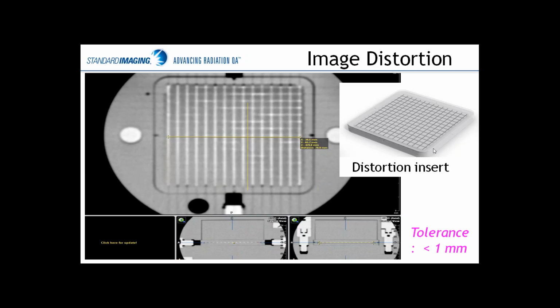The tolerance for this test is typically given to be 1 millimeter or less, and I will mention that most of the clinical information in this presentation has come graciously from one of our Lucy users, Dr. Anil Sethi down in Chicago. So a lot of the tolerances that I'm quoting here are the clinical tolerances that he uses in his program. They may or may not be applicable to your program, but it's at least a good starting point for us to go from.